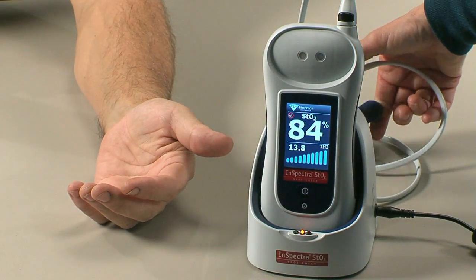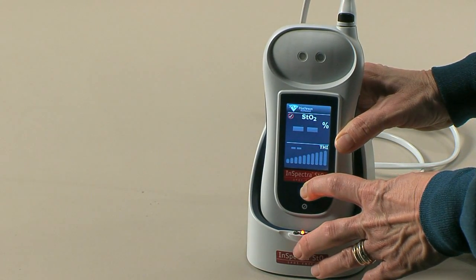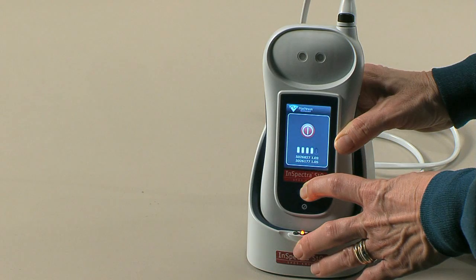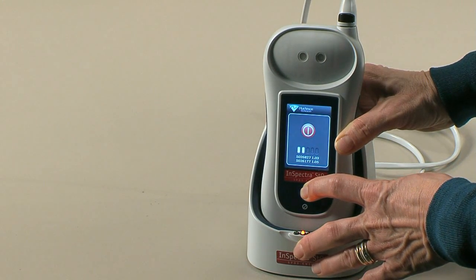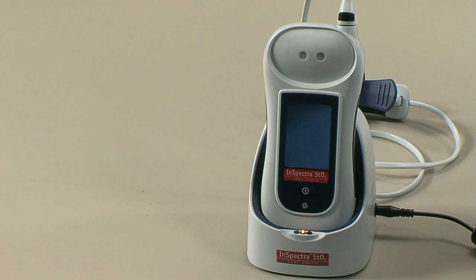To power off the InSpectra STO2 SpotCheck, press and hold the power button on the front of the device. White lines will appear on the screen and turn black as the device powers down, approximately 3 seconds. Releasing the button at any time during shutdown will immediately restore power to the device.